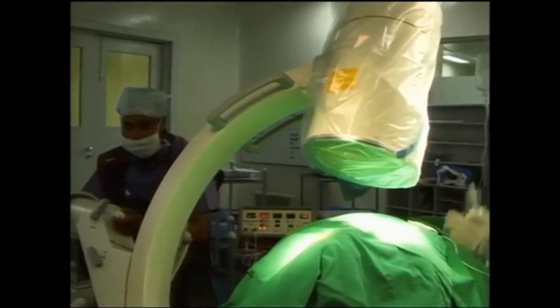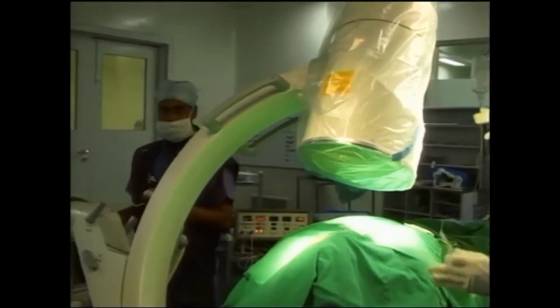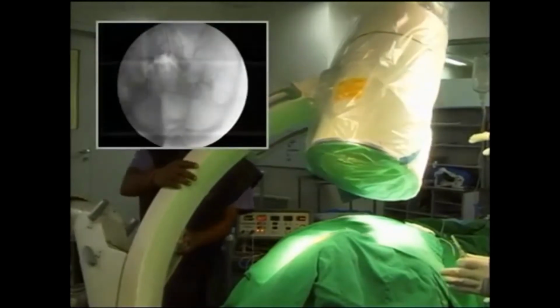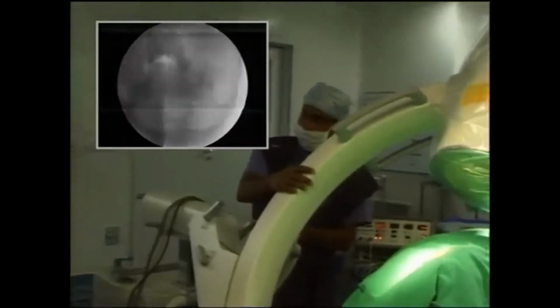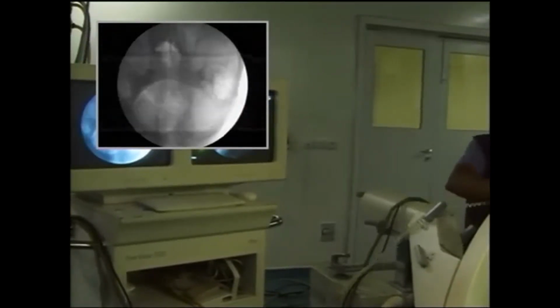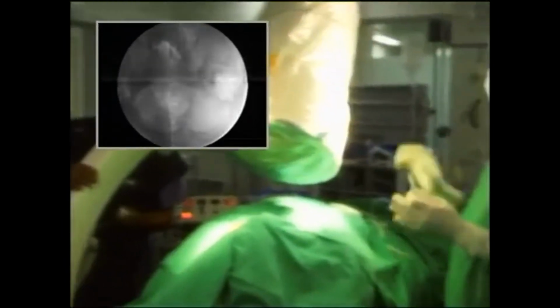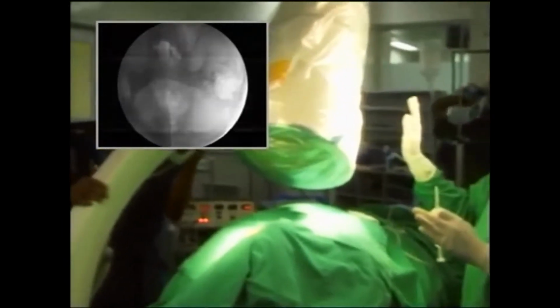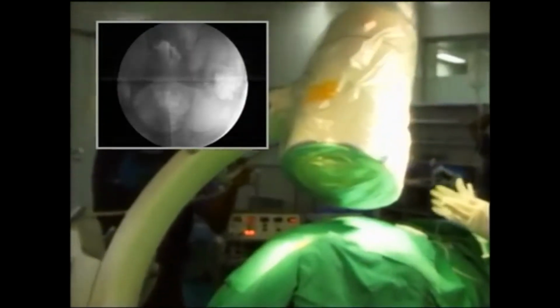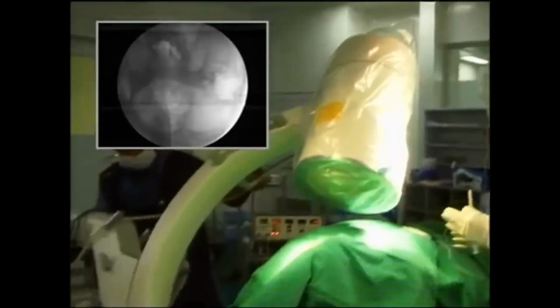No, PIP is not working, sir. Now it's there. PIP is there now. You can see the very big, very nice foramen ovale. Some more? A little towards the head. Okay, I'll come and shoot.